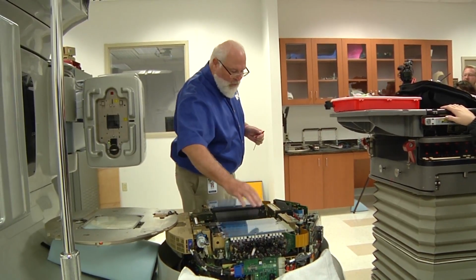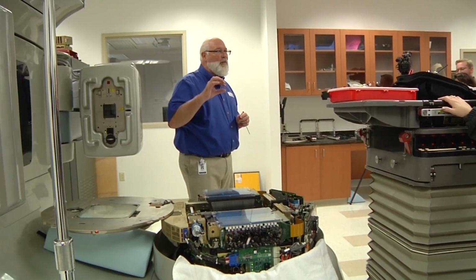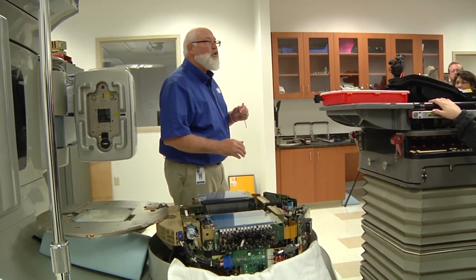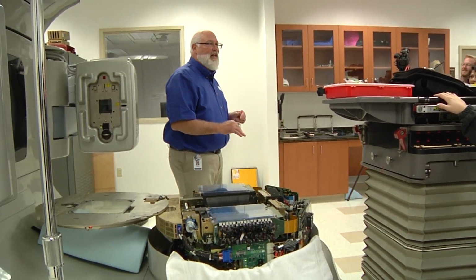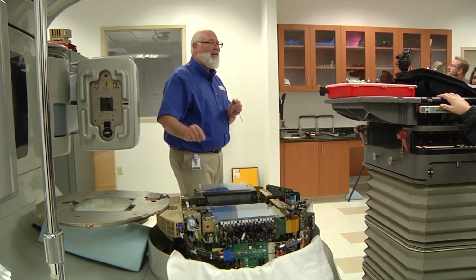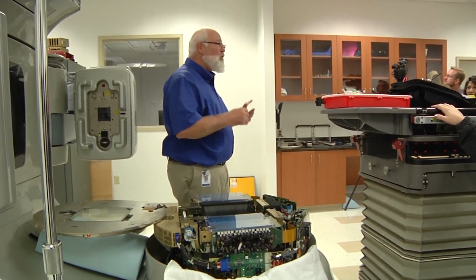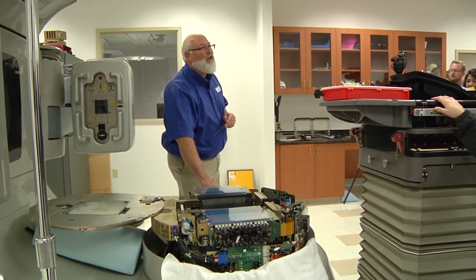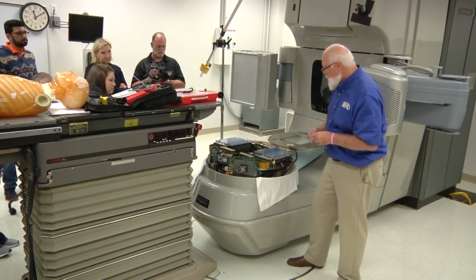One thing you need to be careful with, if you see the ones in the middle, they're kind of a diamond-shaped motor retaining screw. A lot of times you can get the connectors, these ribbon cables, underneath that screw, and then when you tighten it down, you short out the motor, and it does all kinds of weird stuff. So that's one of the things, if a customer of mine replaces their own motors and they're having issues, I'll come and make sure I don't see any of those ribbon cables underneath the screw.